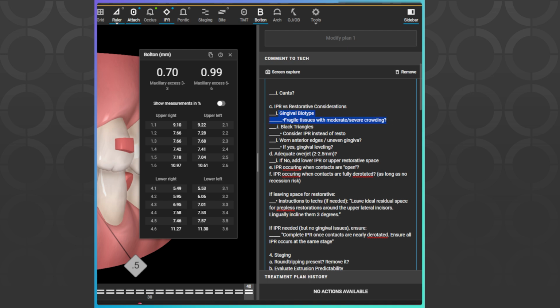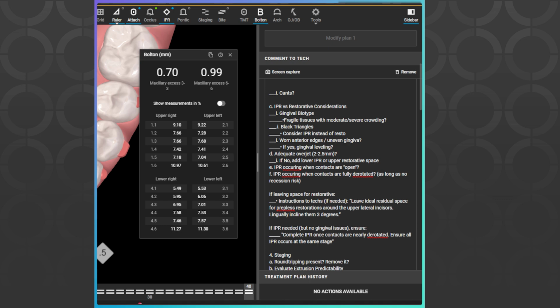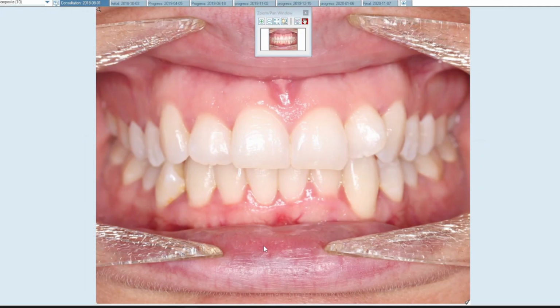Okay, next considerations would be, is there fragile tissue with severe crowding? So are we worried that if we don't do IPR here, we're gonna get recession? So is there a lot of crowding? No, not a lot. But let's go ahead and actually look at the patient's intraoral photos so we can see how good does their biotype look.